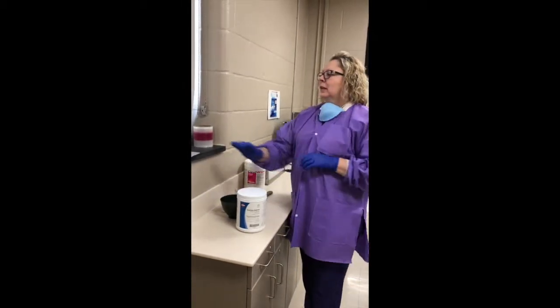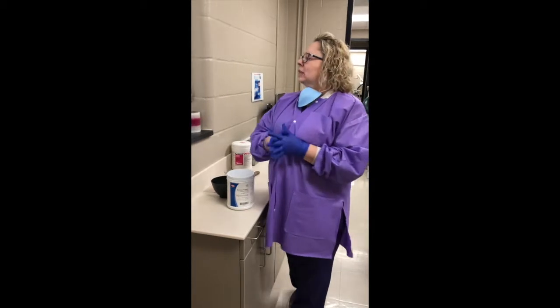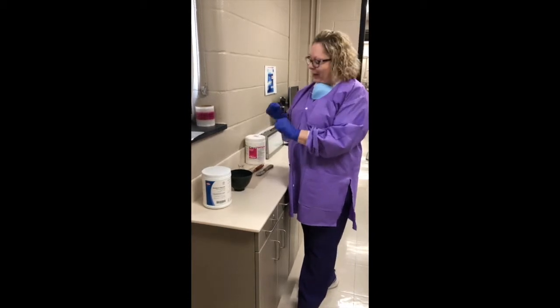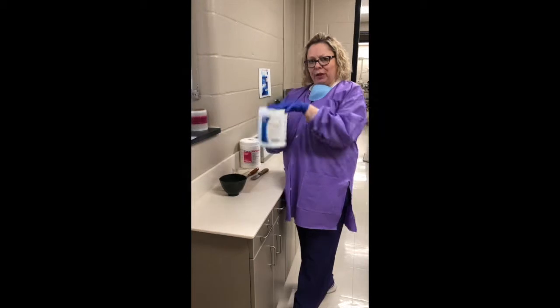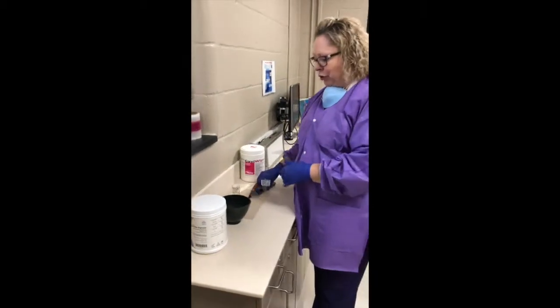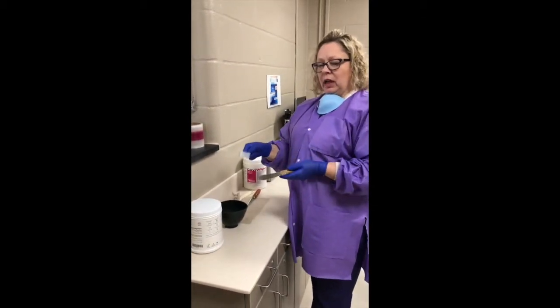Okay, so the goal of our exercise today is for my students to learn, one, how to assemble the proper materials, armamentarium we call it in dentistry, to learn how to fluff the material accurately, and to measure it properly, which is you fill the scoop and you use your little scooper to get off any excess so that you have a nice level scoop.